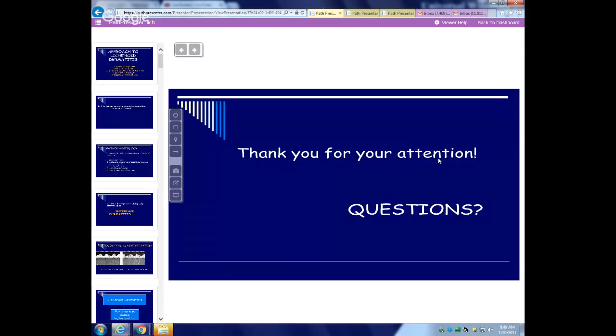But this, you can use PathPresenter, it is a free tool to use. Just go into PathPresenter, import your PowerPoint. There are like 6,000 slides on the cloud right now, which you can just use for your presentations. I showed you how to annotate the slides, how to put them in your presentation, and you can do this from anywhere, anytime actually. So I think it makes pathology presentations much more interactive and much more useful.